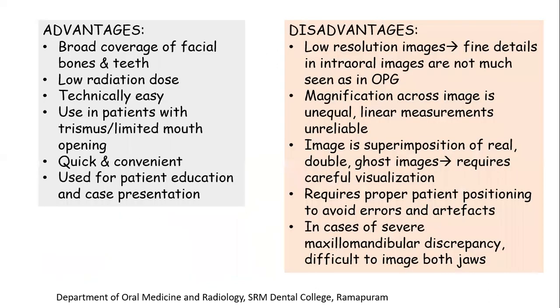So what are the advantages and disadvantages of OPG? Advantages include broad coverage of the facial bones and teeth, low radiation dose, and it is technically easy. It is used in patients with trismus or limited mouth opening. It is quick and convenient and used for patient education and case presentations because it provides a general assessment of the dentition. Some of the disadvantages would be a low resolution image.